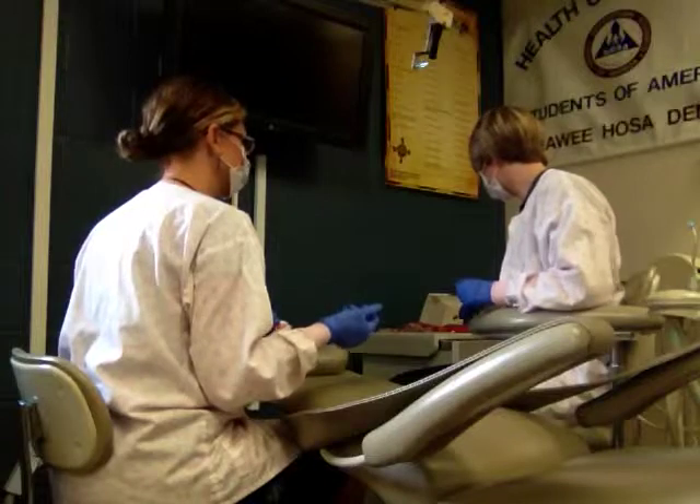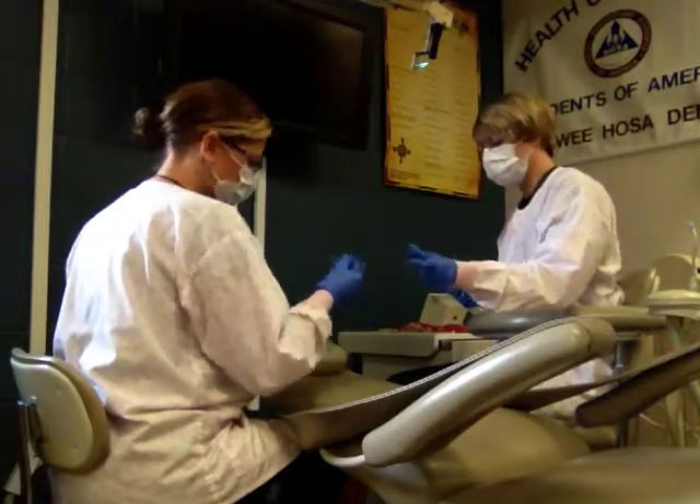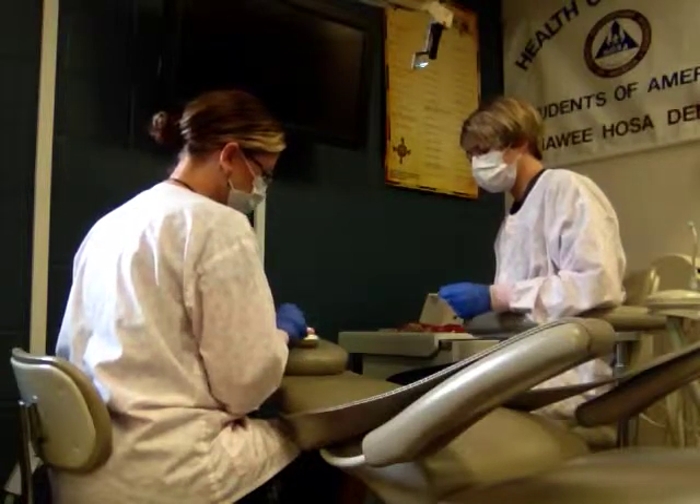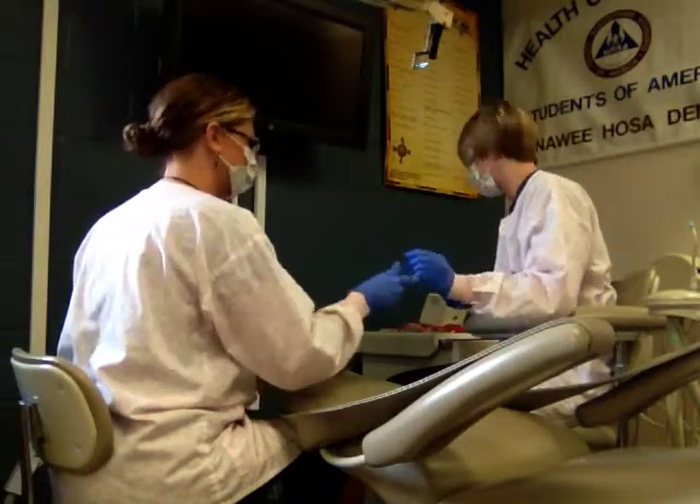Now we'll do the bonding. Place the bonding with that little blue microbrush, and then we need to light cure it, so the assistant will grab the curing light.